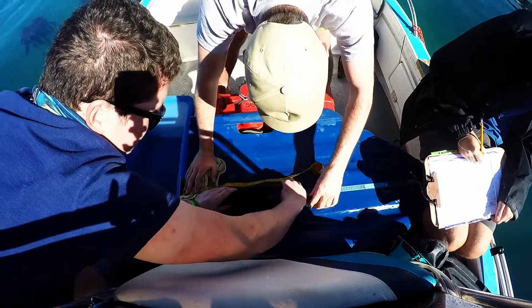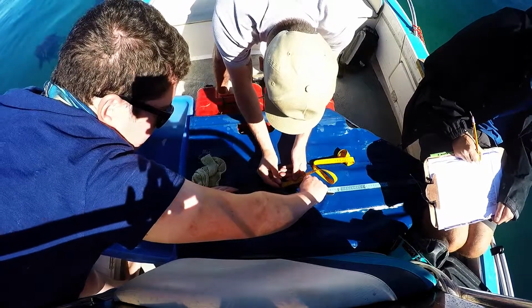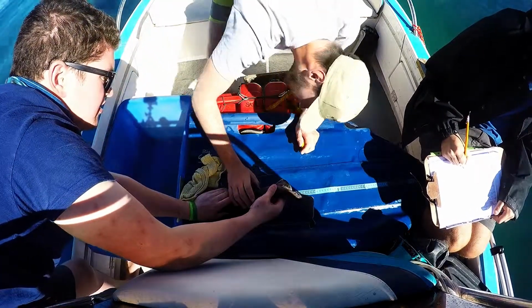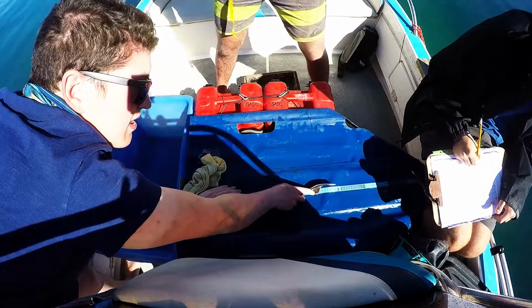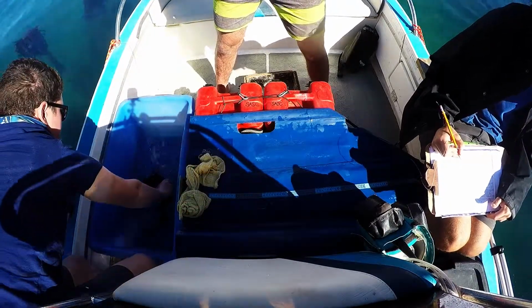These 3 measurements are standard fisheries measurements and contribute to species identification, taxonomic clarification, and increase in the understanding of morphometrics and general understanding of sharks. They also allow growth to be calculated should the tagged animal be recaptured. The shark is sexed by checking for the presence of claspers near the pelvic fins. If the claspers are present, this indicates a male.